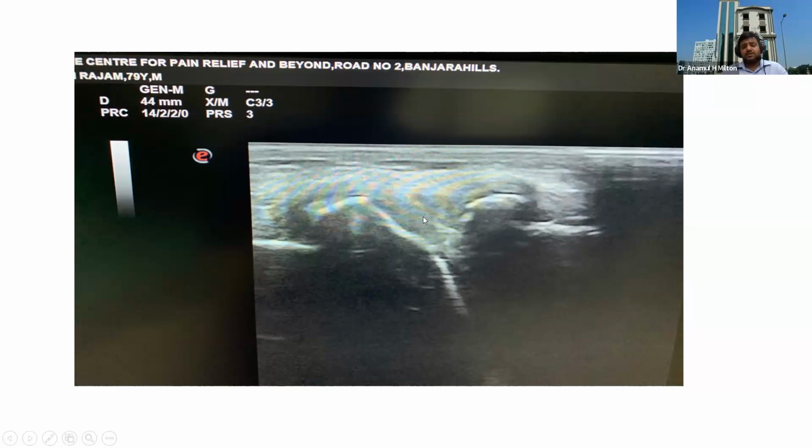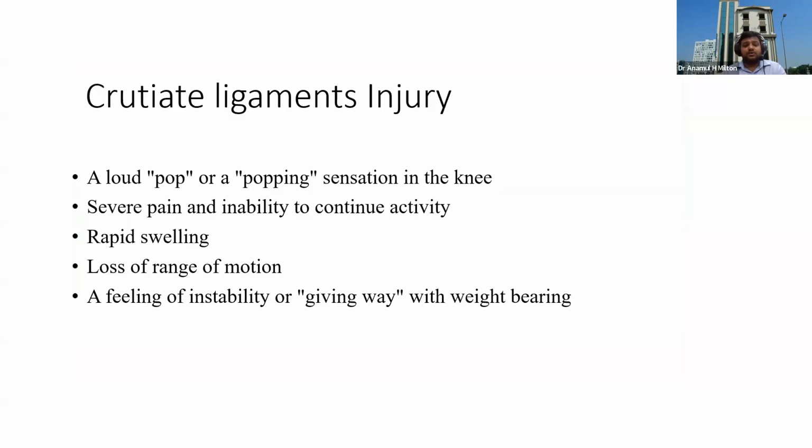and the joint space is very narrow. So the meniscus goes uplift and is pushed, and the medial collateral ligament is also uplifted. So when the meniscus is pushed and popped up, the total mechanism is changed. So it causes continuous irritation because there is a big osteophyte, and it causes pain during movement, and there is pain also. Okay.